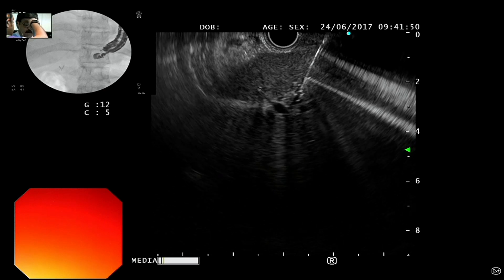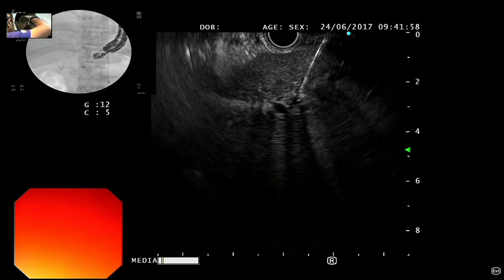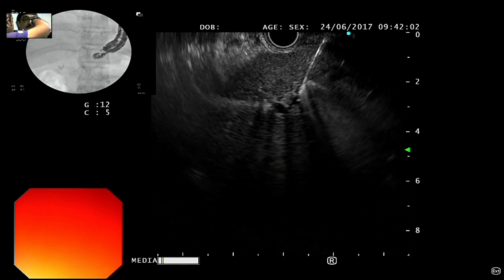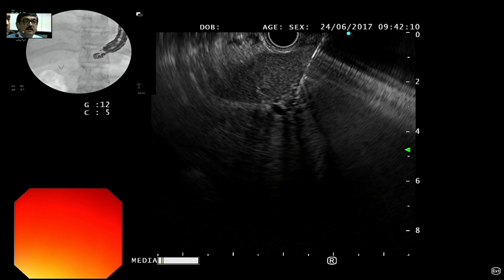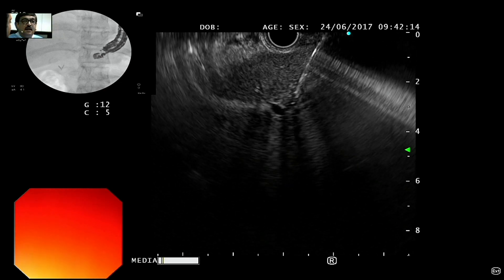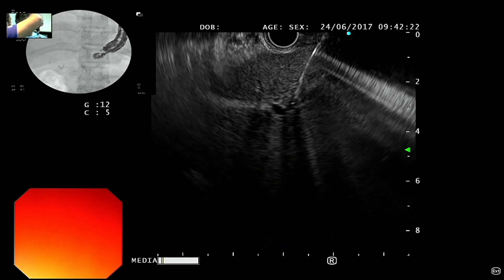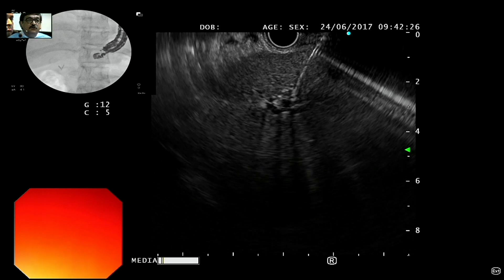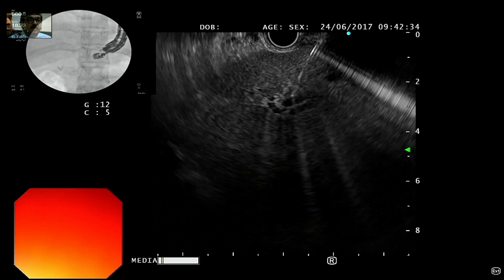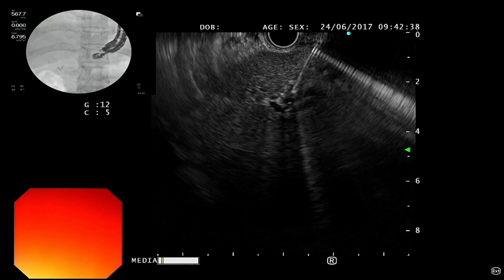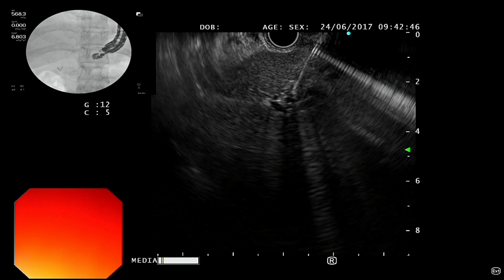Now we will aspirate the bile to see whether we are in the right area, because if you are somewhere else — this is a very small target. I am not getting the bile. Let me push a little more. I am in here. The only thing is the radical is not very dilated. One more try. On the other side also there is a biliary radical, so I am safe that way. We got bile now. I think this is okay.